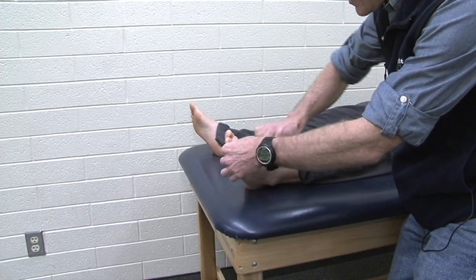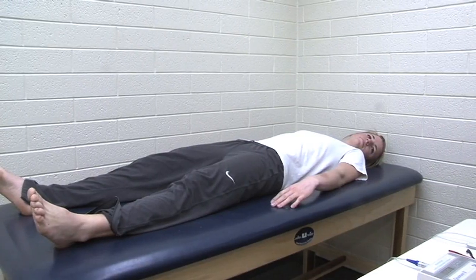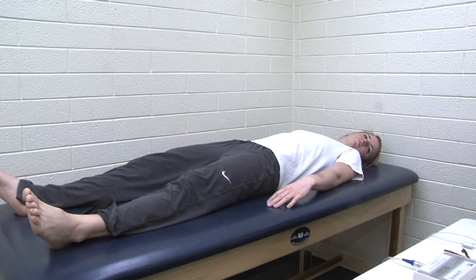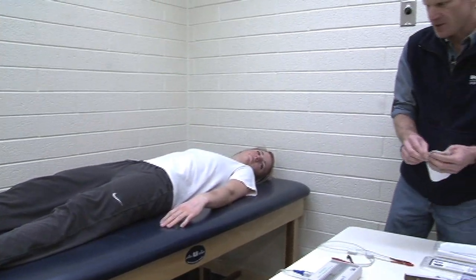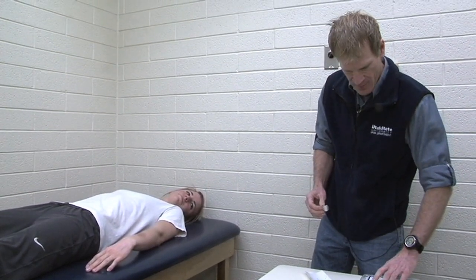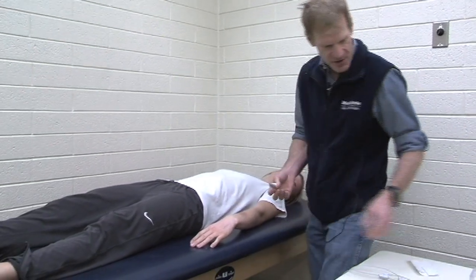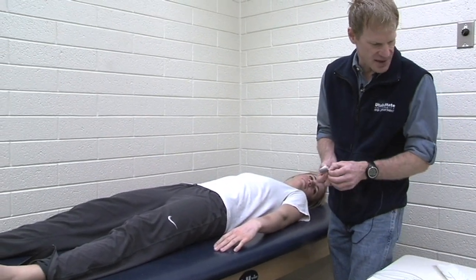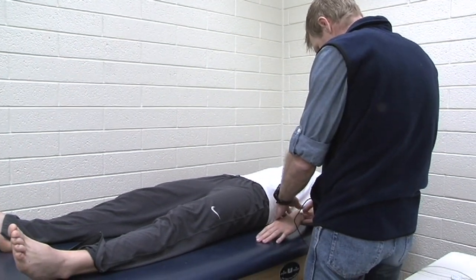We're going to use the same side of the body for those electrodes. Traditionally, we measure things on the right side. This is a relatively easy procedure — it's not difficult for the client or the examiner, so that's probably one of the benefits of this method. However, despite the fact that it's an easy procedure, you still have to be very precise on your landmarks in order to get an accurate reading.